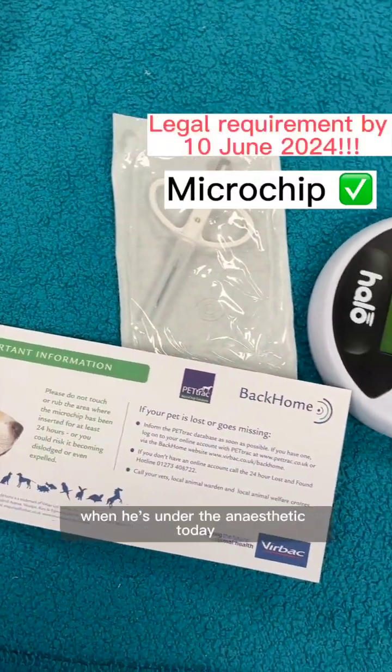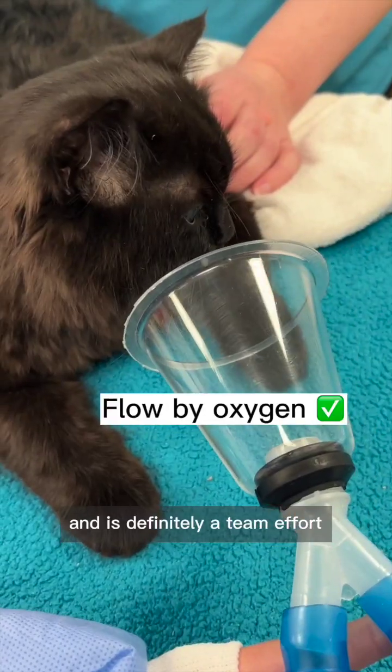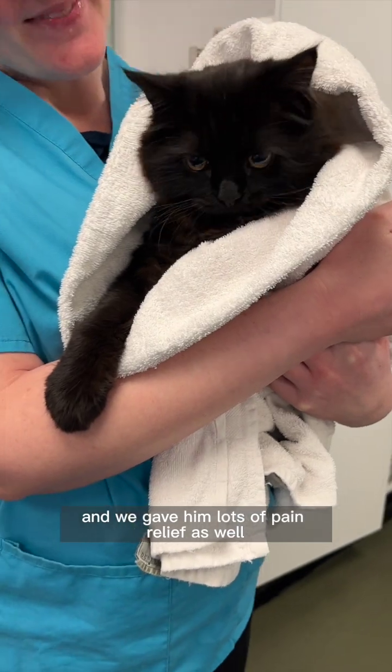He will also be microchipped when he's under the anesthetic today. This is the setup — you can see there's lots of equipment and it's definitely a team effort. Here he's enjoying some oxygen with my colleagues, and then we start the procedure. It's a fairly quick procedure to remove his testicles, and we gave him lots of pain relief as well.